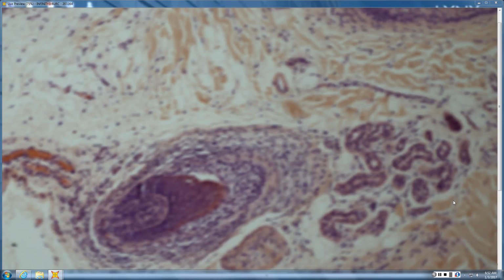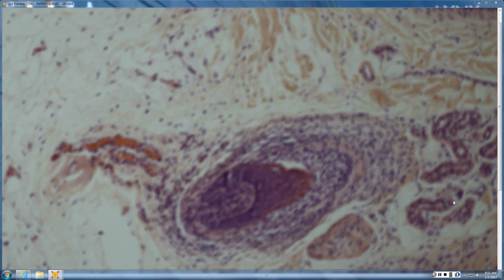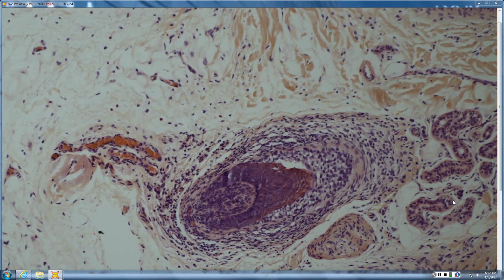And then some of those other features that you look for. Let me see if I can find some good examples here. We're going to go sideways. So seeing the lymphocytes not just around the bulb, but actually within the bulb, hints a little bit more at alopecia areata, because it's most likely targeting the melanocytes in this area. And then seeing eosinophils is almost pathognomonic. You can see here, from this altitude, these little eosinophils.